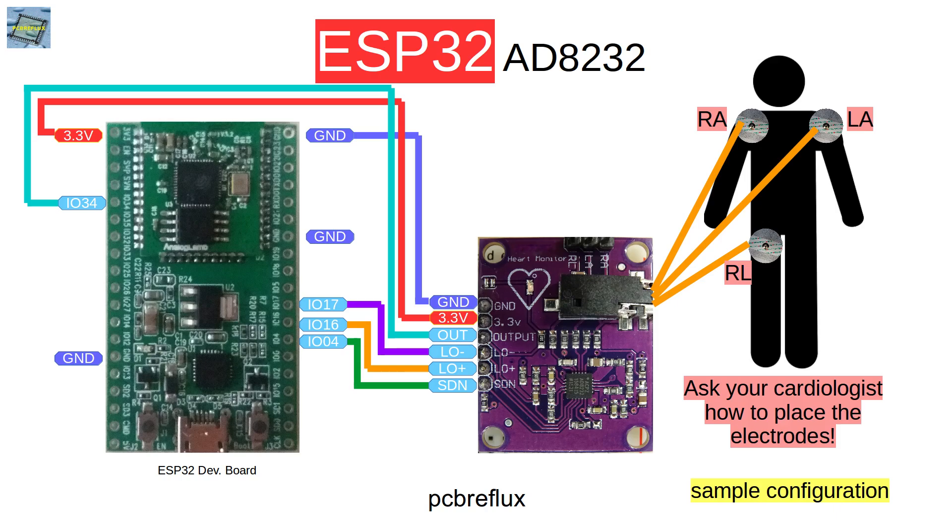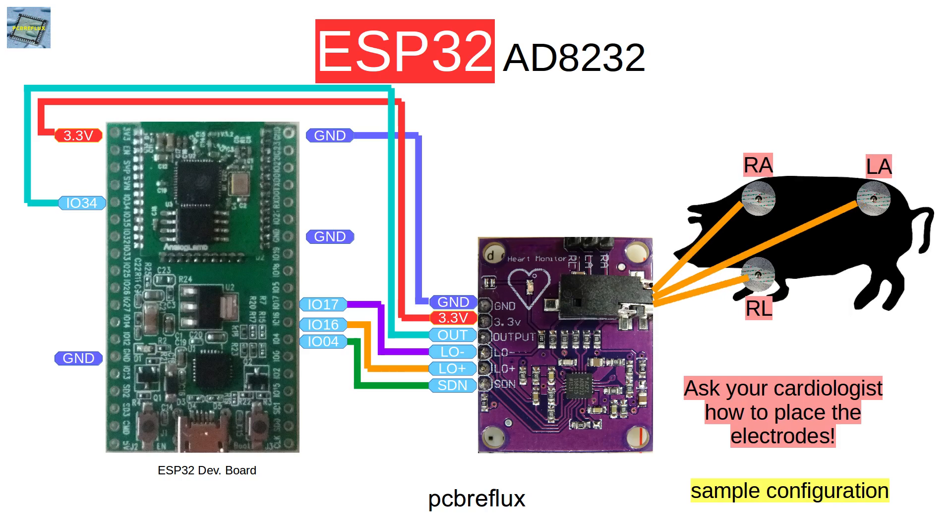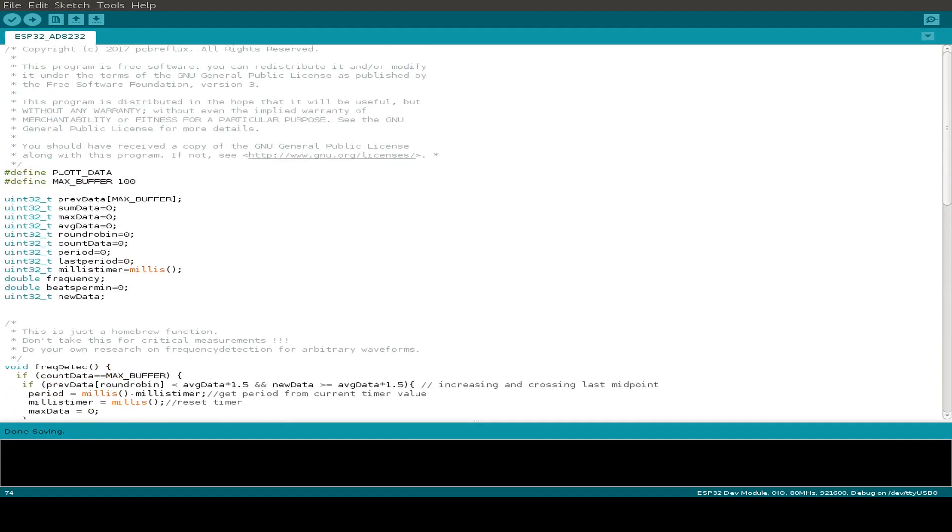We also have to connect the electrodes. I'm not a cardiologist, so please ask your medical advisor for any real application when doing the electrode connection. We have three wires: the wire from the left arm electrode, the right arm electrode, and the right leg electrode. And we can not only use this for a human body — we can also use this for pets or animals.